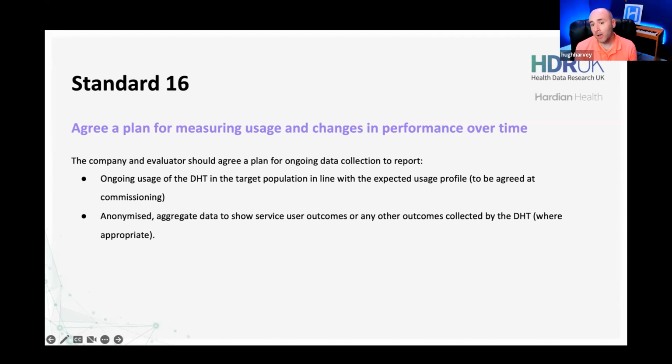So this is going to be a really interesting part, I think, of future software as a medical device evaluations coming to market. And a big focus of health technology assessments by NICE will be looking at how do we actually safely and accurately monitor for changes in performance over time.